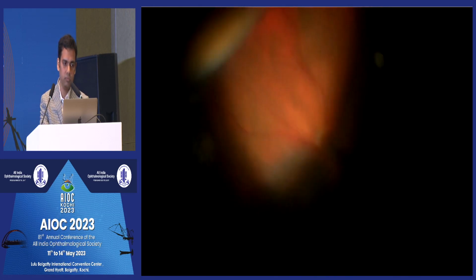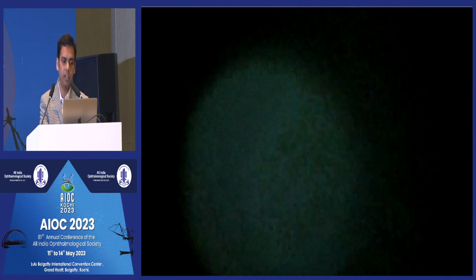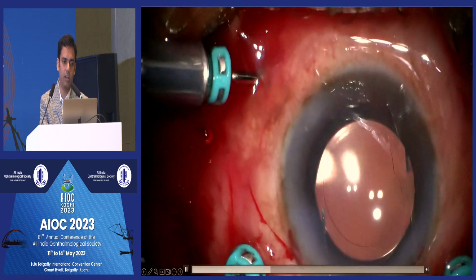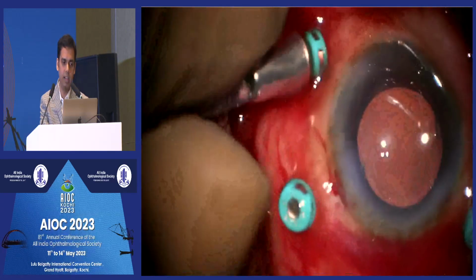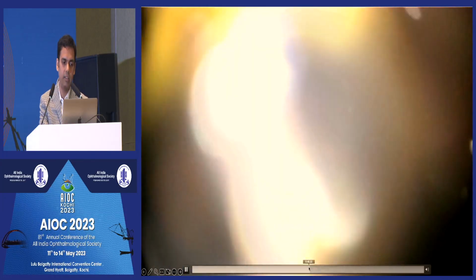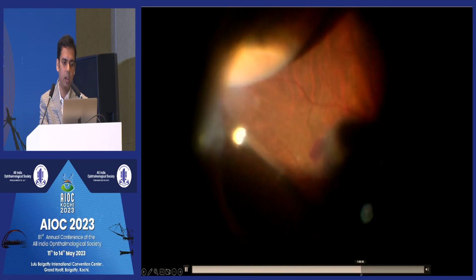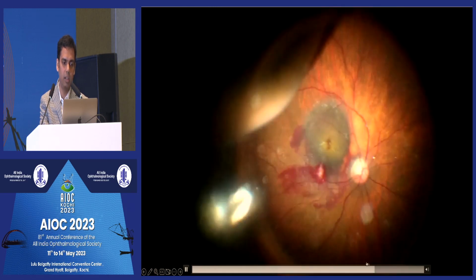Further sequence of surgery will depend on how much the detachment is and what the indication of surgery is. Most of the time, if it is limited, you can go on. Now you can see the infusion cannula has been retracted. It is off from the inferotemporal cannula site, and again it was reintroduced, visually inspected, and then restarted. However, as it was in the inferotemporal quadrant where there was choroidal detachment, with increase in the amount of fluid, we can see that the choroidal detachment has further increased from the previous episode.